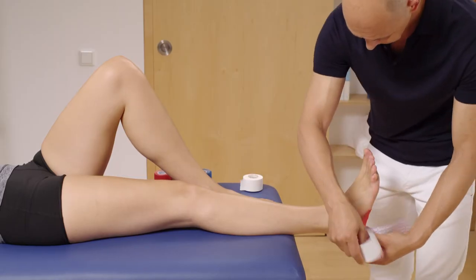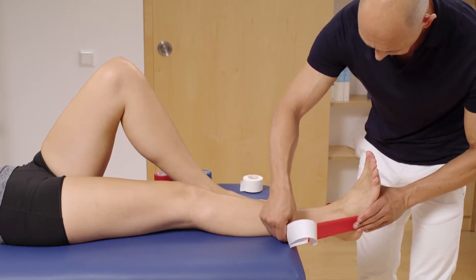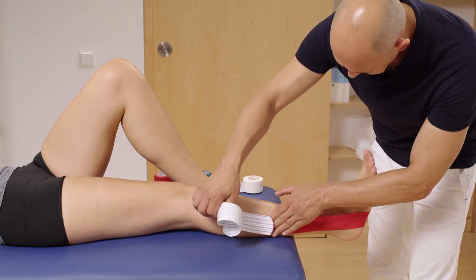Place the foot in the required position. Now pull over the tape with tension. Then stick on the end of the strip and rub the middle part of the tape strip.